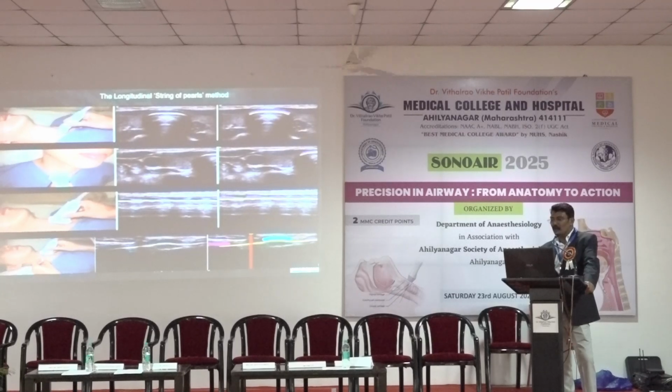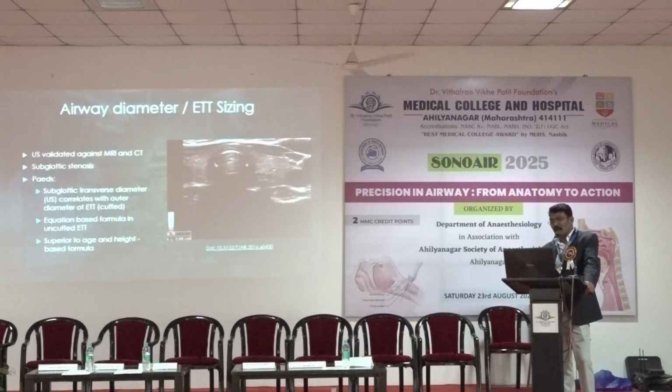One more thing I would like to show you is calculating the diameter of the airway, particularly in pediatric patients or neonates, where you will be able to calculate the size of the tube which you can put into the airway.